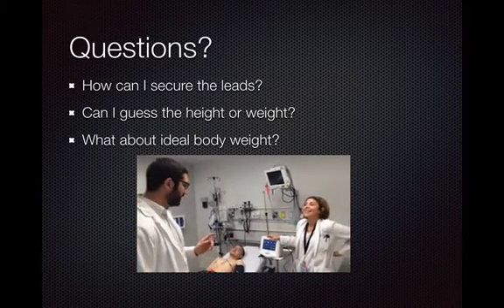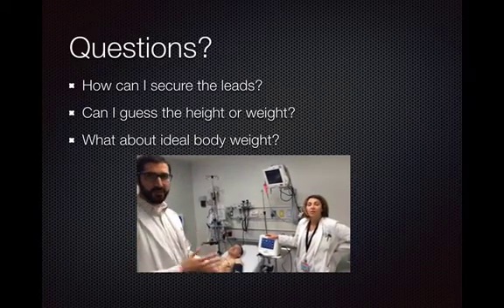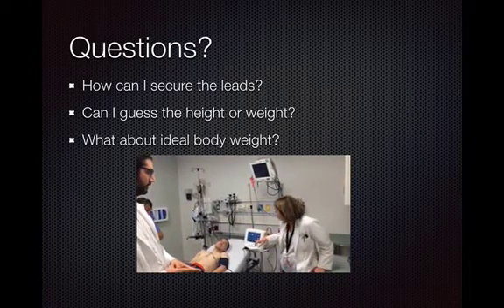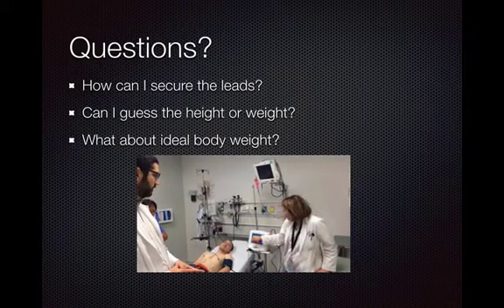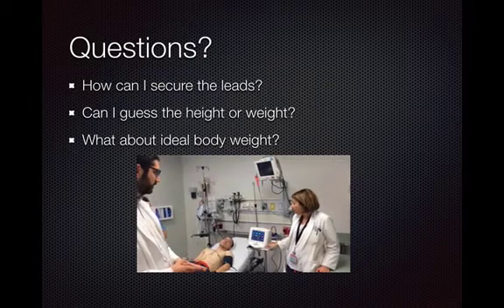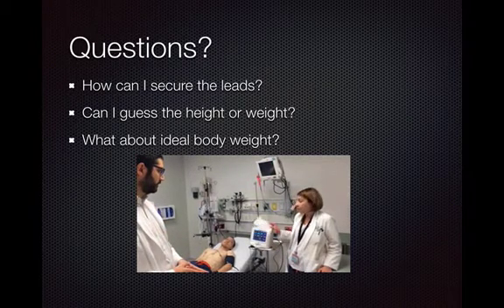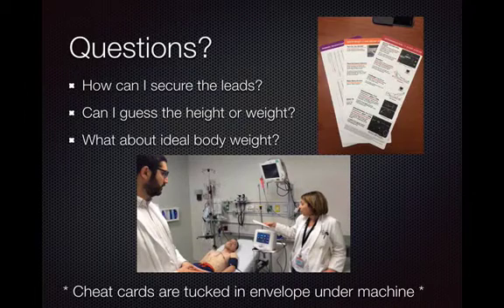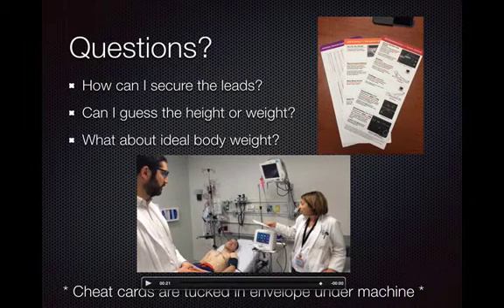Dr. Weingrove, when we're using patients' body weight, are we going to be using actual body weight or ideal body weight? Actual body weight, because you're going to calculate an index. On the other screen, it gives you cardiac output, cardiac index, stroke volume and stroke volume index. If you forget what the normals are, they're on this cheat sheet. Like Dr. Stein said, you're using the actual body weight, not the ideal body weight. There are some references in these guides provided by the Cheetah NICOM company, and they're tucked into a clear plastic envelope underneath this machine right here.